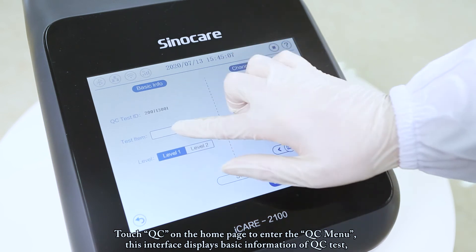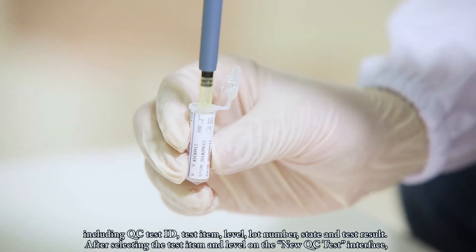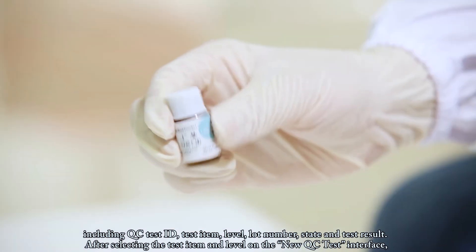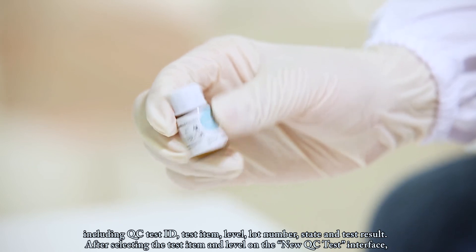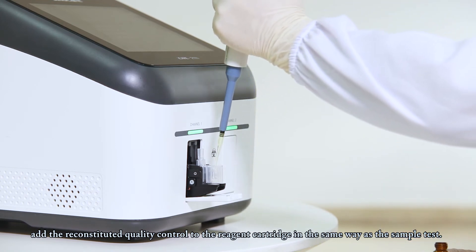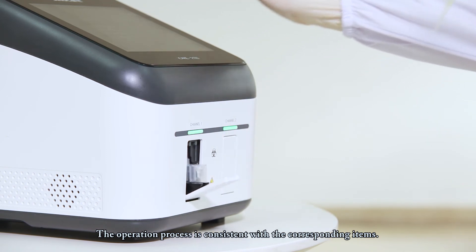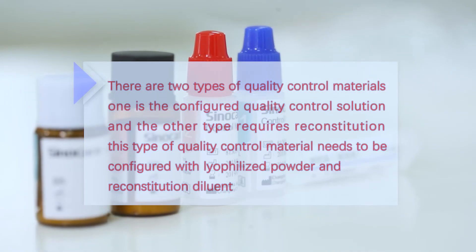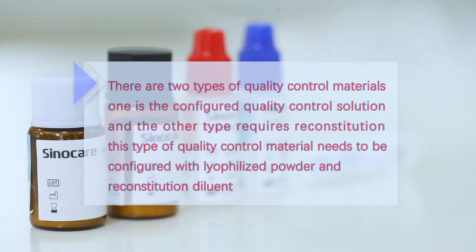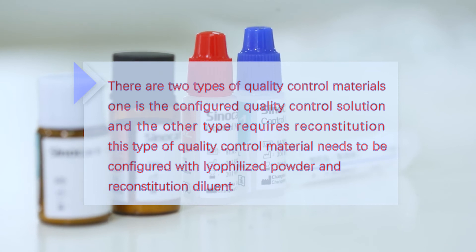Touch QC on the home page to enter the QC menu. This interface displays basic information including QC test ID, test item, level, lot number, state, and test result. After selecting the test item and level on the new QC test interface, add the reconstituted quality control to the reagent cartridge in the same way as the sample test. There are two types of quality control materials: one is the pre-configured quality control solution, and the other requires reconstitution of lyophilized powder with reconstitution diluent.